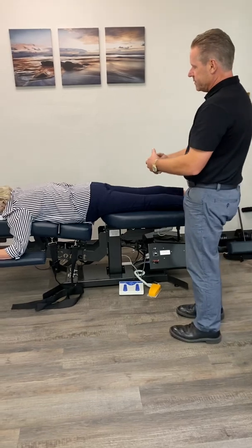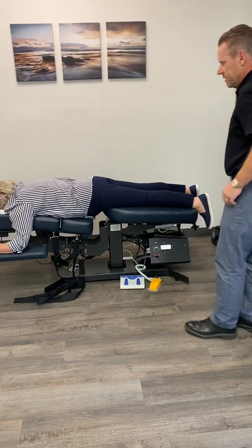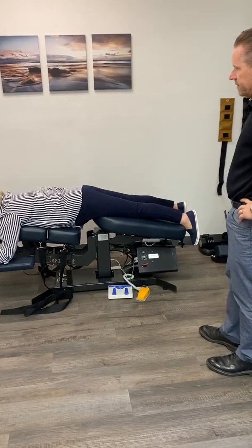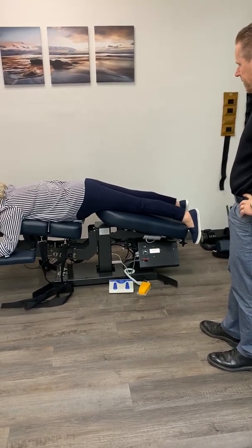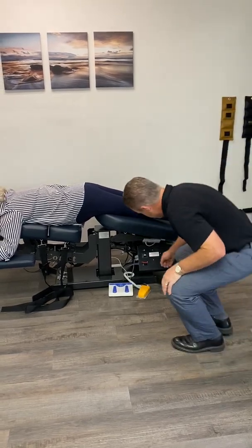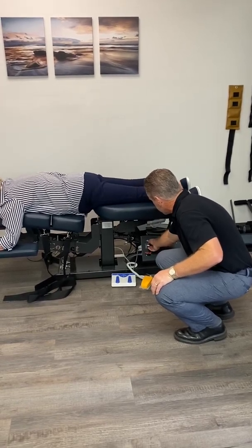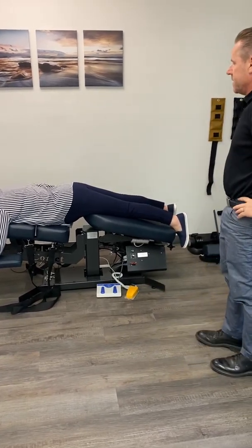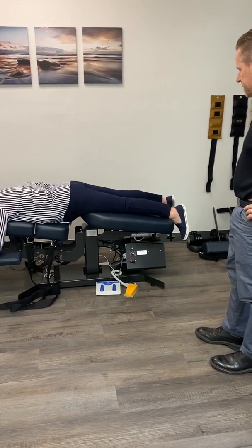Now that we've warmed you up and added a little bit of traction, we can go back with the movement again. And this one, you're probably going to feel a little bit more than before. How are we doing with that? I felt it, but it's not painful. Okay, and so now we're going to increase the speed here. I actually think you'll like a little bit of speed on this. So now we're at about 30 degrees per second. And then your job is just to relax. That should feel good.